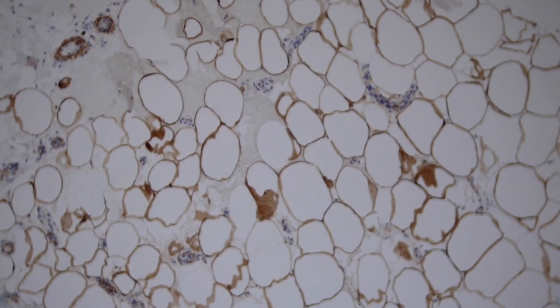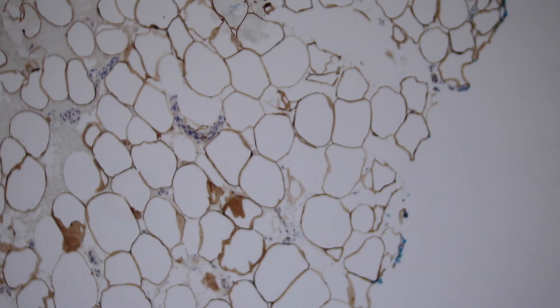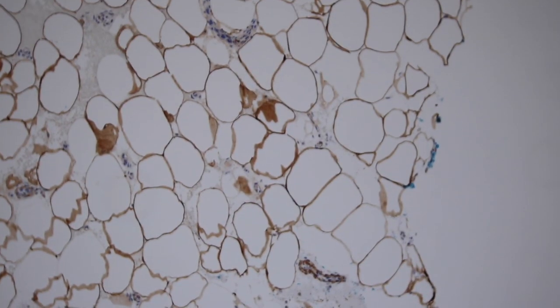And then also fat adipocytes tend to stain with S100 as well. So you can see S100 staining these fat cells here in the subcutis. S100 is not a very useful stain for fatty tumors but it does stain normal fat. And it will stain nerve as well, but I didn't have a good nerve to show in that piece.